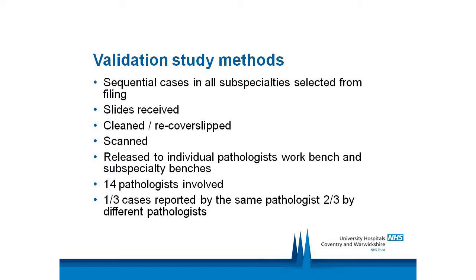All the subspecialty areas were targeted, and the slides were retrieved, they were recover slipped, they were scanned, and then after the 3-week period had elapsed, they were released to pathologists to re-report. And 14 pathologists took part in this study. 2/3 of these cases were reported by a different pathologist on the digital compared to the glass. The remaining were done by the same pathologist on both, and that very closely mirrors what happens in our routine MDTs.